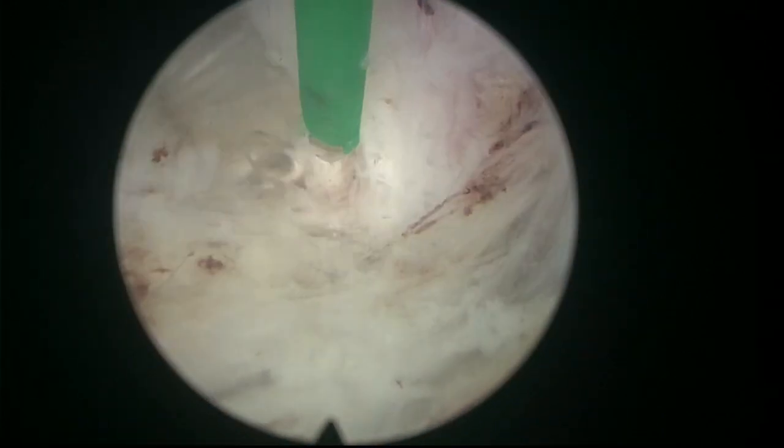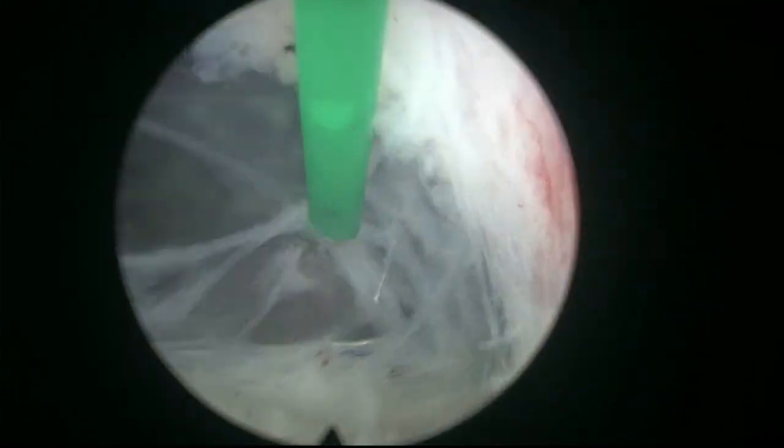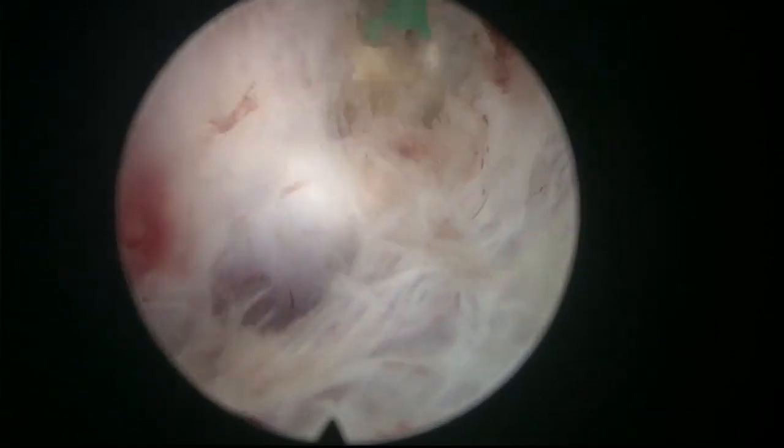Here we are, that's the entry to the bladder. You can see the vertical fibers here corresponding to the landmark. That's a mucosa from the bladder that is ballooning because of the water pressure in such a small space. So it's not nice because the mucosa dissects a little bit from the silk here. There's some dissection of the mucosa. It's peeled off the bladder neck, and that can cause sometimes a little bit of bleeding.